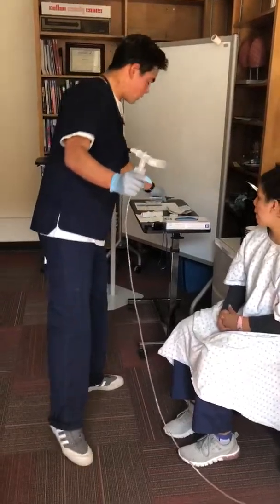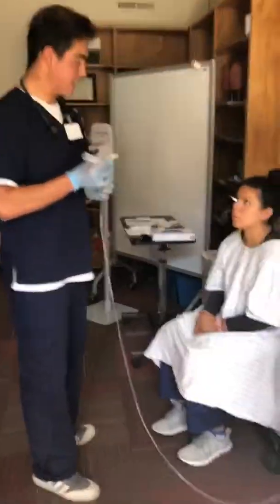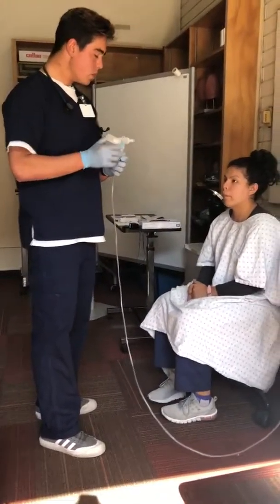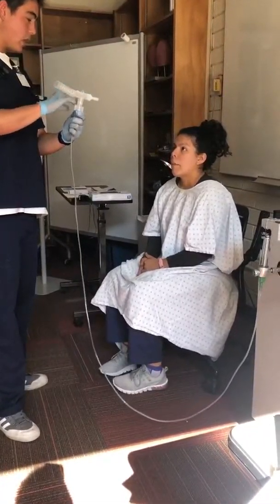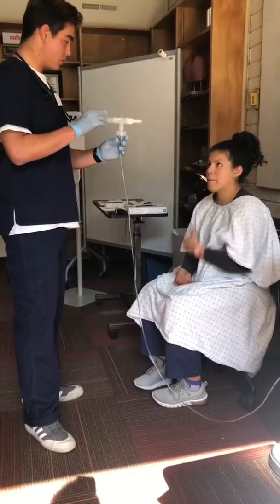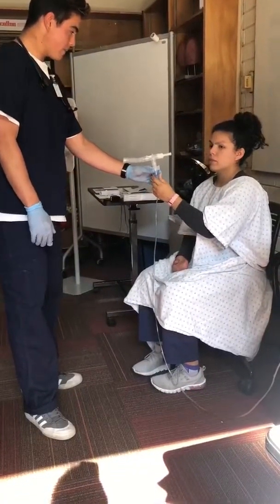Okay, so I'm going to go ahead and turn on the wall outlet to 6 to 8 liters per minute. We're going to do 8 liters per minute right now because she's able to tolerate that. So when we do this, we're going to place your mouth over the mouthpiece, okay? Tongue underneath and your teeth gently sitting on the mouthpiece. And then purse your lips around that. We're going to take a nice regular breath. You can go ahead and hold that.